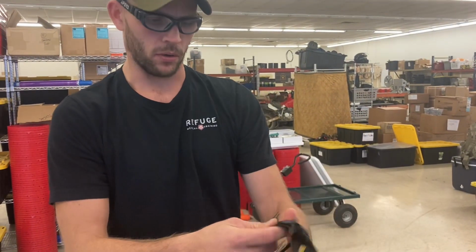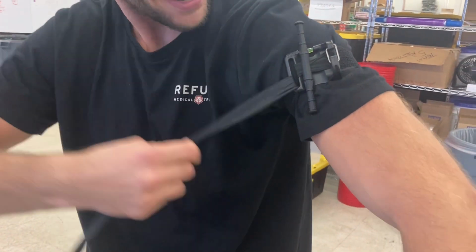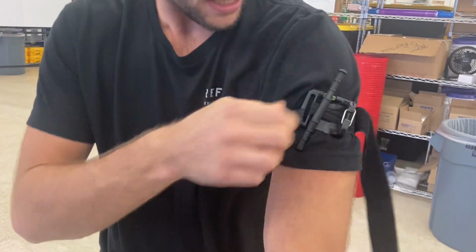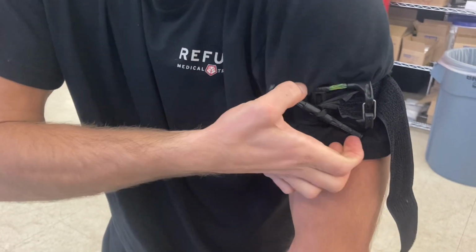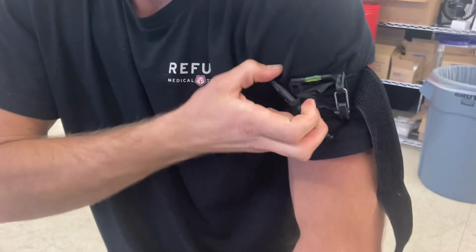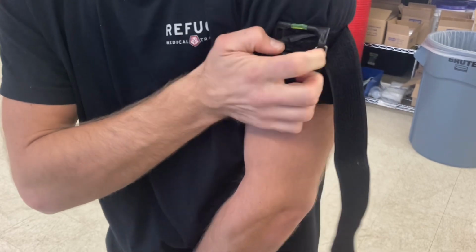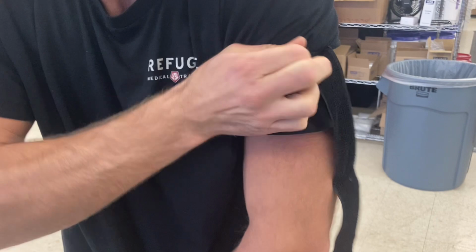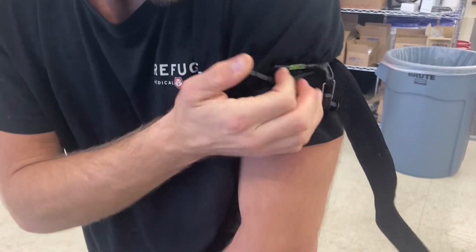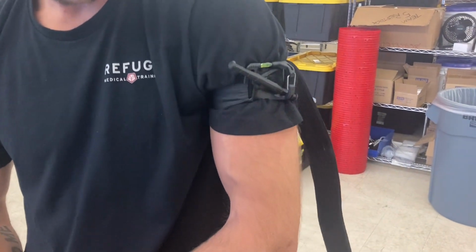Okay, so now we're pretty equal. Good enough. All right, so same deal. So I'm gonna watch. Pull it tight. It's already doing it again. It immediately went down. Yep. Okay, but we'll complete it, and I'm gonna purposely twist the opposite direction. We'll see what happens. Which again is awkward because we don't use our hands that way. I don't have compression yet, and it's even locked in. I didn't mean for it to be. Now we've got compression. Okay, so that way makes sense. Yeah, and it worked.